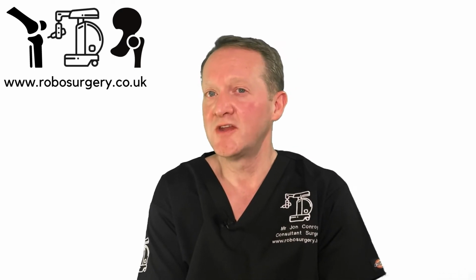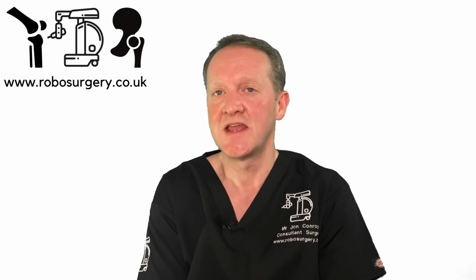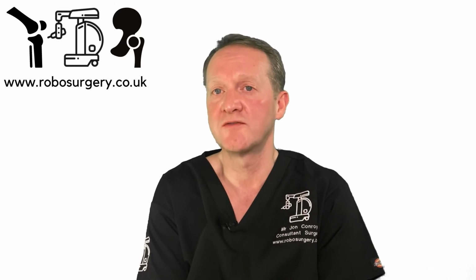In my opinion, not only the leg length is important, but the offset is a measure of how tight the hip is. If we can accurately place the hip and reduce the excessive tightness in the hip, this can also help patients in their recovery.